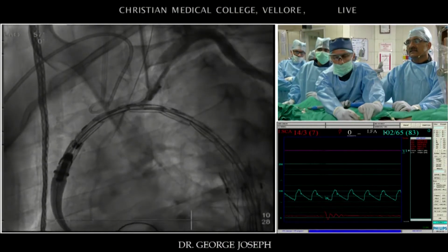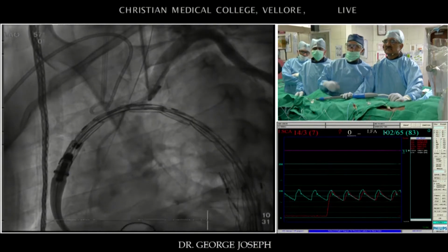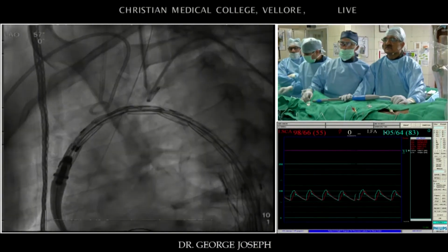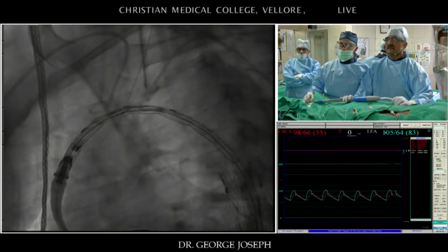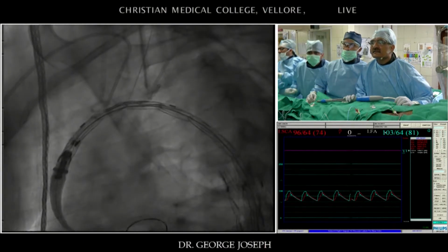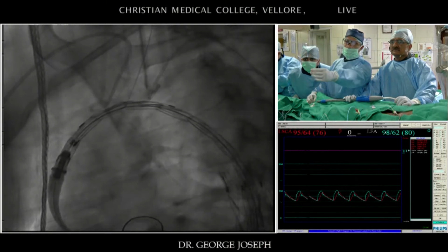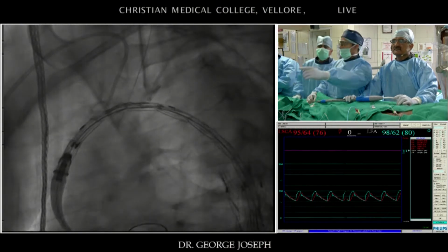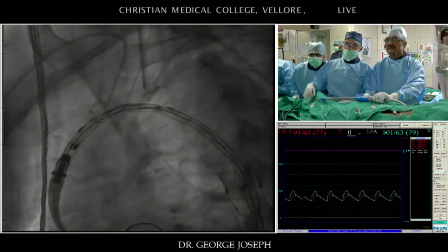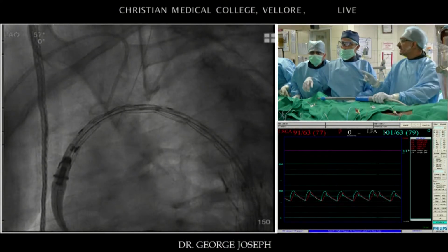So the left carotid needs to go in a bit more, no? Slightly more. Yeah, the whole thing can go in there. That's more. In the middle, you can see the subclavian fenestration. It appears you might have to push it in a little bit, right? No, I think the left subclavian has gone ahead too much, no? It's under it. Can we just look at our graft picture again?